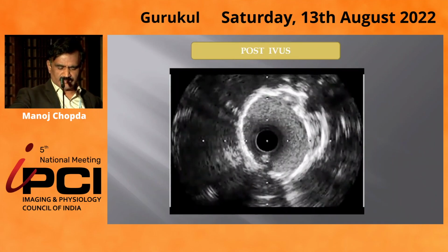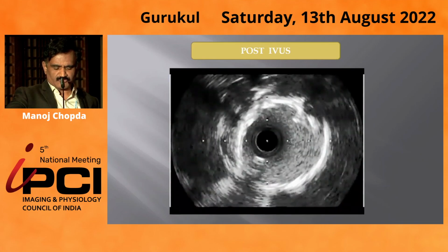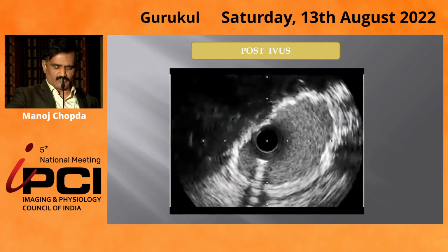And on the post-IVUS imaging, we could achieve a good MSA of more than 9.65, proximal and distal very well, and the stent was apposed well.